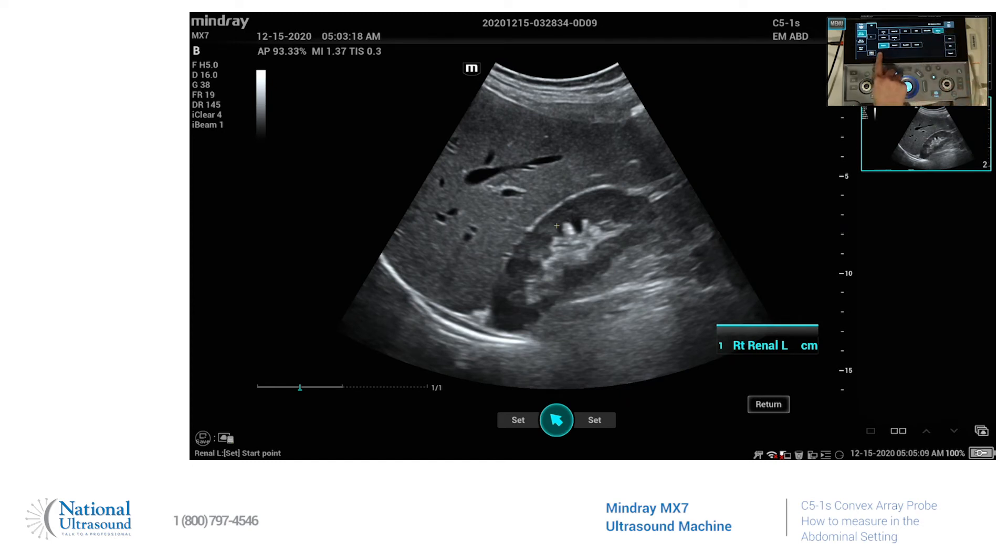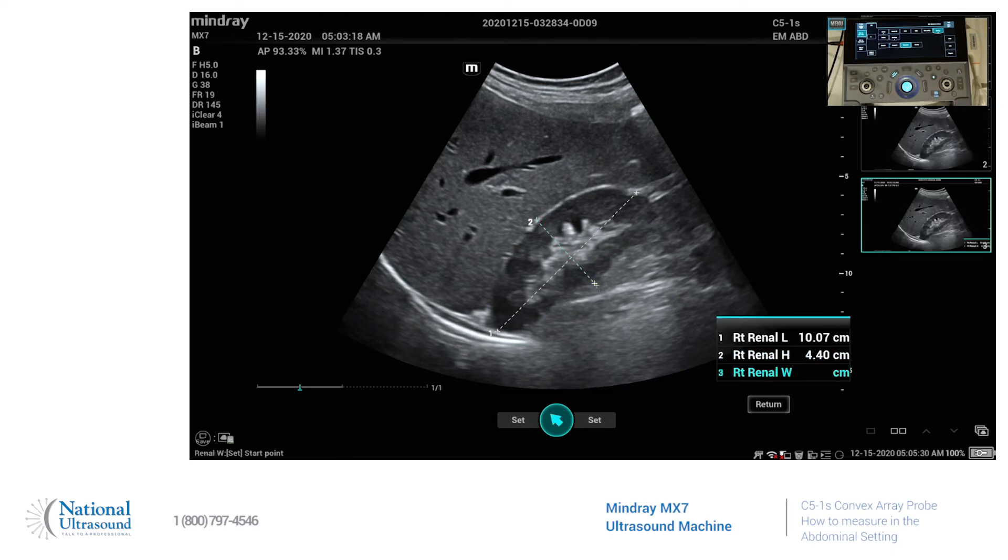So go to kidney — it's on renal length — and these are your set keys. You can use either one, and then we'll bring up renal height. It automatically comes up as it's the next one in the calc package, and we'll save that, and then it automatically brings up your renal width.